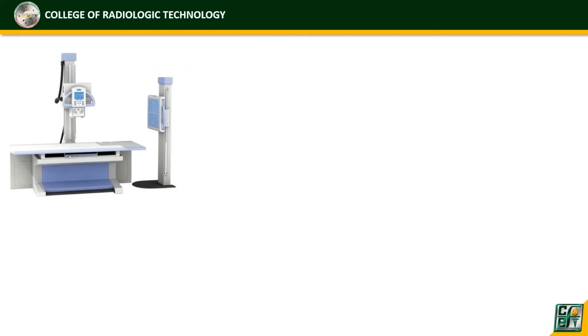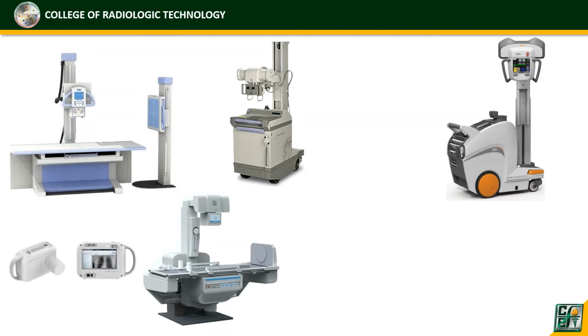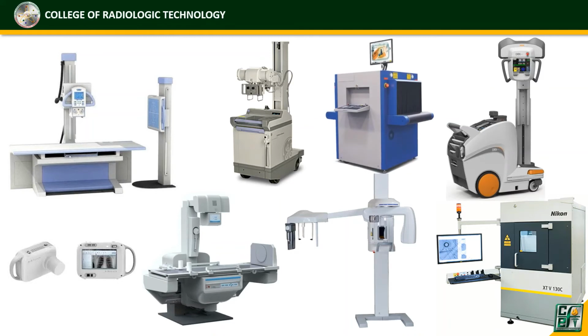So let's have a recap. What are the three types of X-ray machines? We have the fixed type X-ray machines, the mobile X-ray machines, and the dedicated X-ray machines.